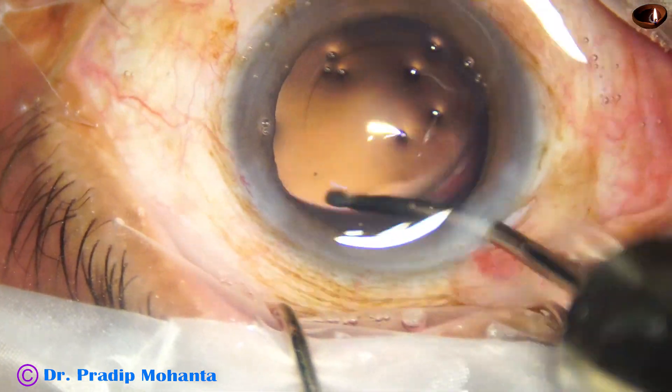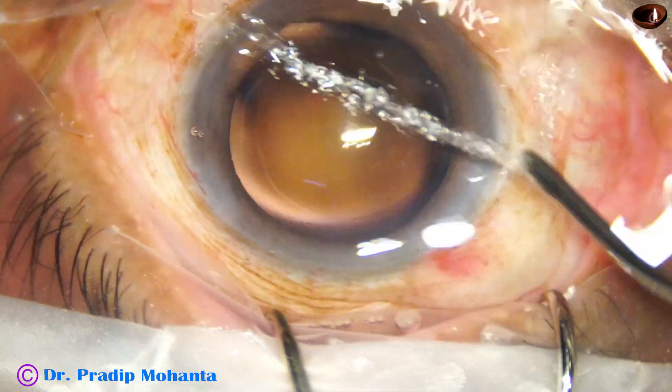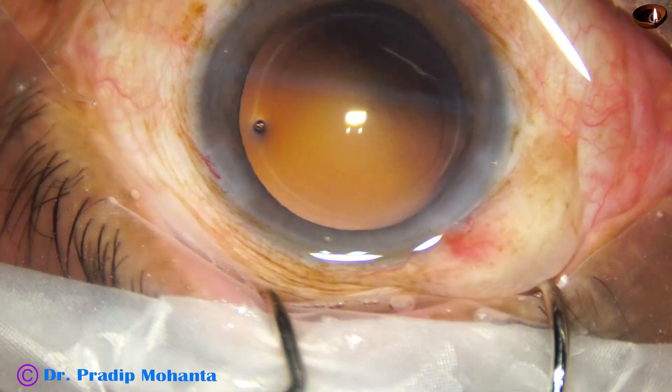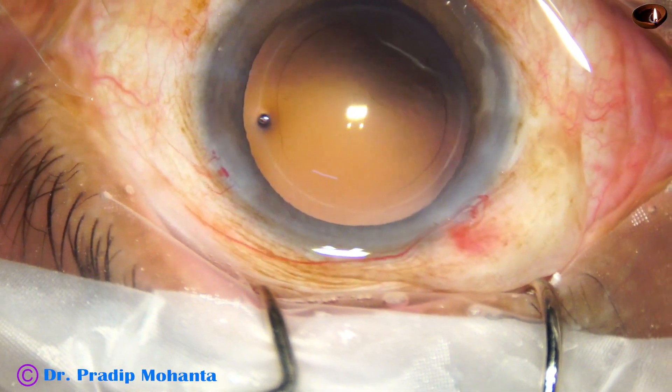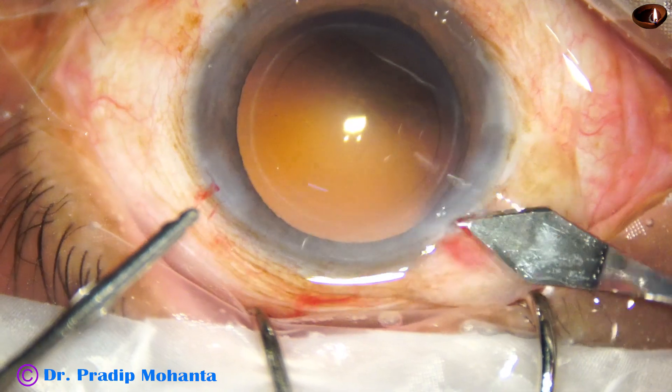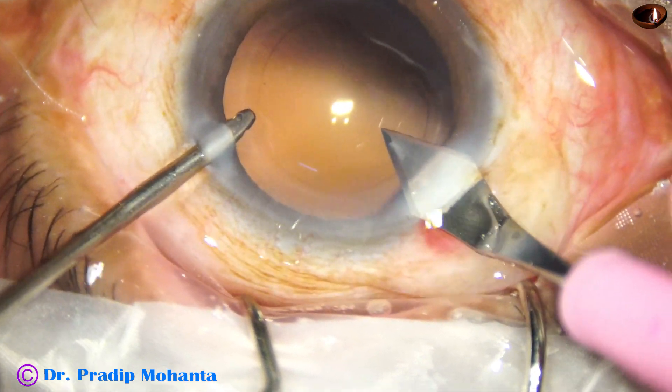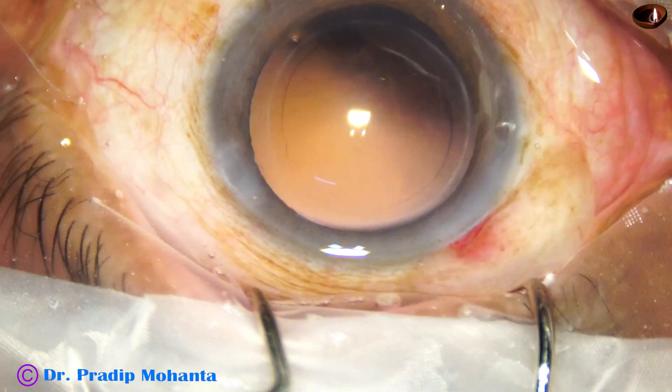Some lens epithelial cells sticking to the posterior capsule are hydro-polished — those cells are removed by the irrigating cannula. The main wound is then enlarged to about 3 millimeter.